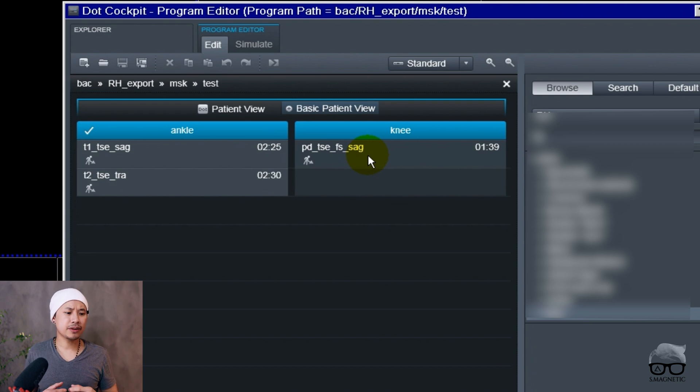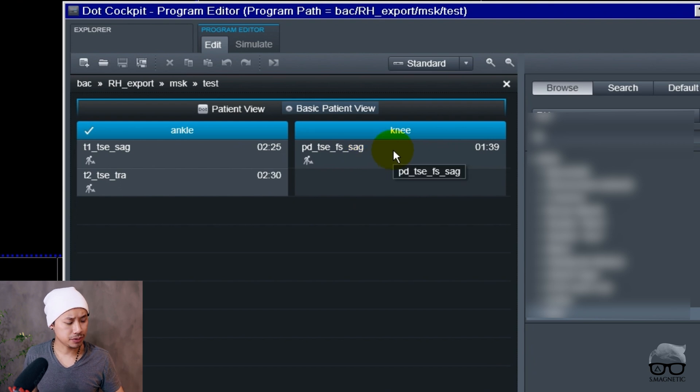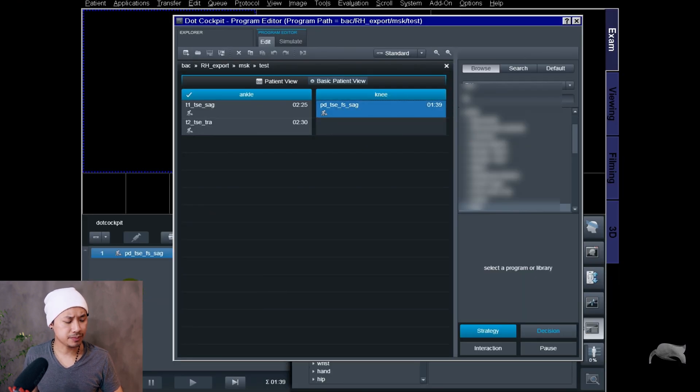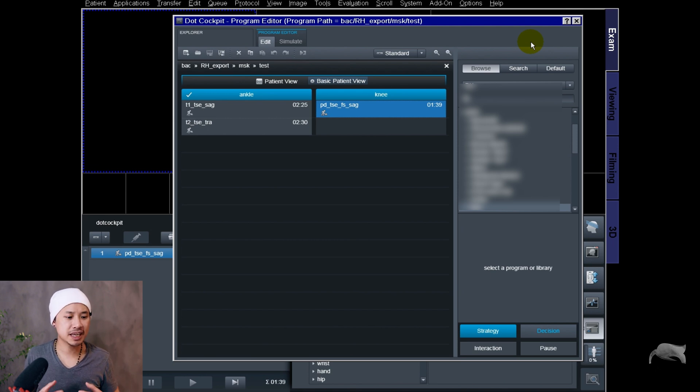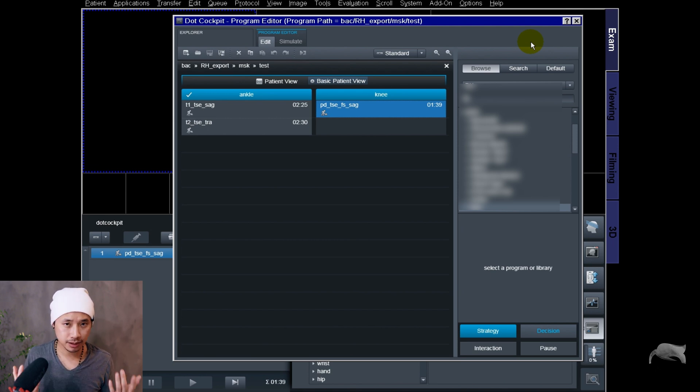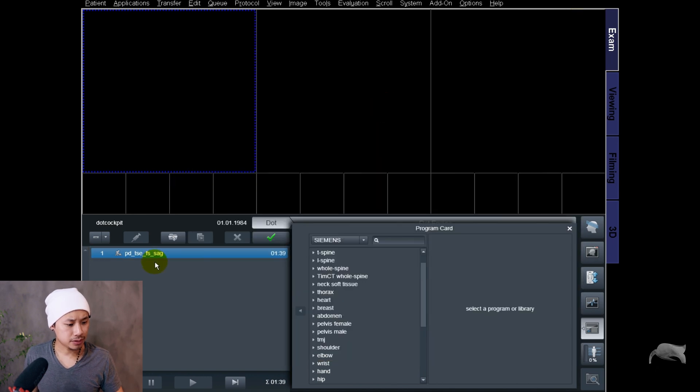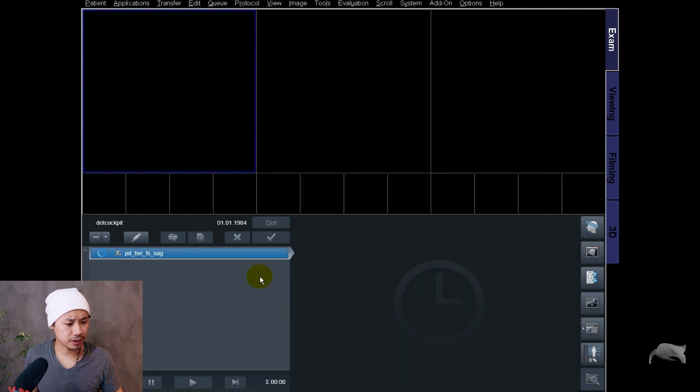Let's say you have a very good sequence from the knee and you want to use that one. Let me show you drag and drop. Remember this knee protocol you see in front of you now is saved to the knee coil. I just close down, open that one, and then you get a message.